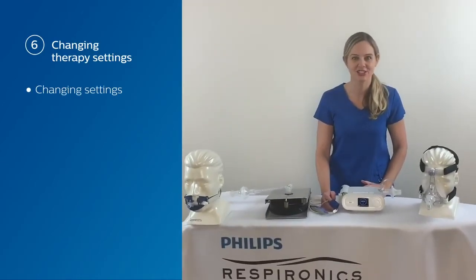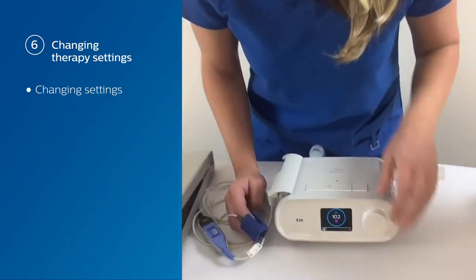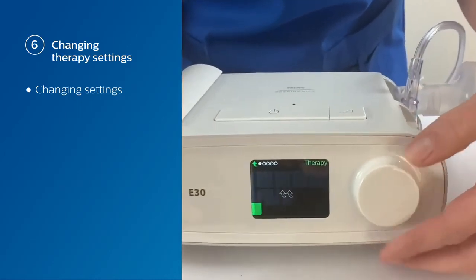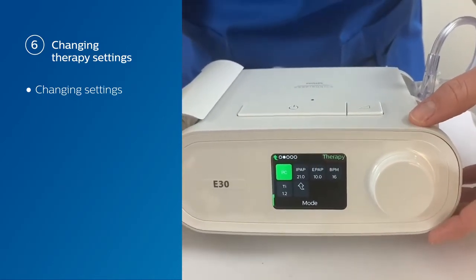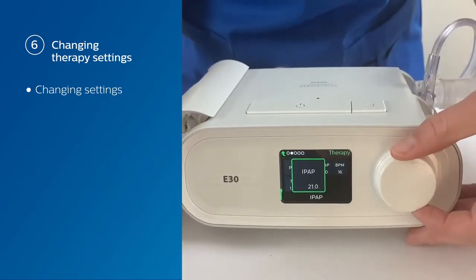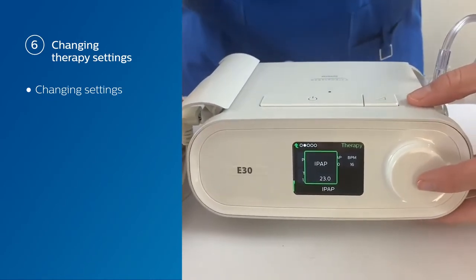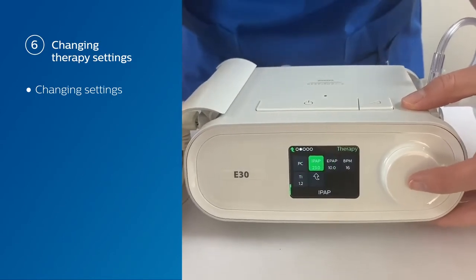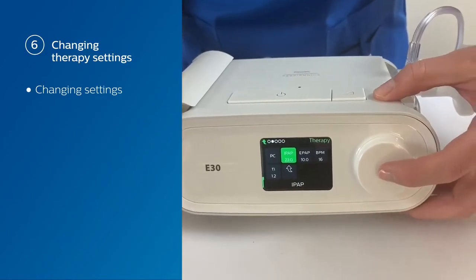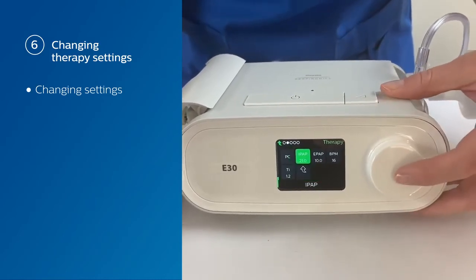Now we're going to discuss how to change the therapy settings or modes while you're actually ventilating. All you need to do is change over to your therapy screen. You can see that we're using PC or pressure control mode at the moment. We're going to slide over to your IPAP. If we wanted to change the IPAP — in this case we're going to increase it — that change won't take effect until you tap your control dial. Now our IPAP has increased. If you want to change it back, just tap that again and rotate the dial back to the setting where you were.